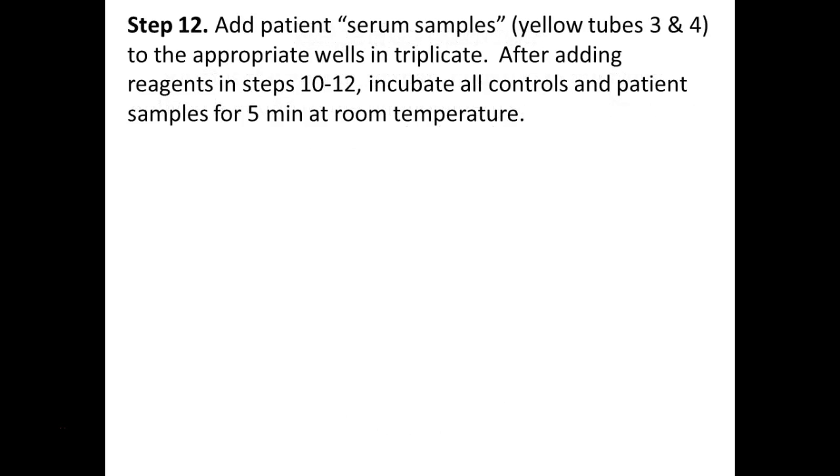So we're obviously going to run a test today. You have two patients, Mr. Number 3 and Mr. Number 4. You can pretend you're testing for whatever you want to test for, whatever antibody you think is cool. One of these guys is going to get good or bad news depending on what you're testing for, right? And the other one is going to be the opposite result. Your challenge today is to find out who is positive and who is negative for the primary antibody.